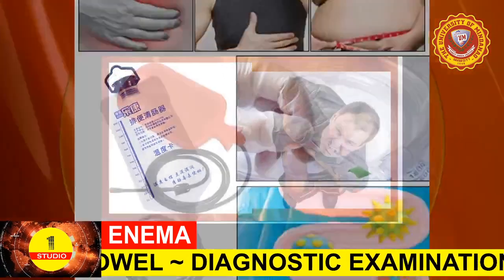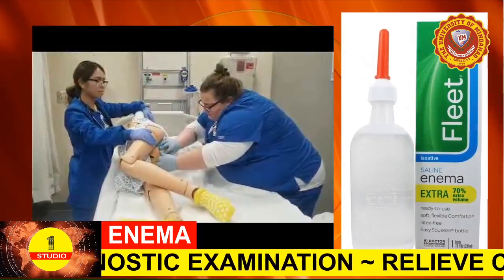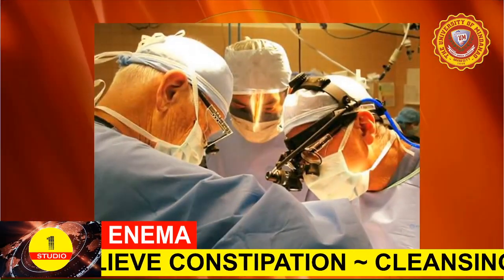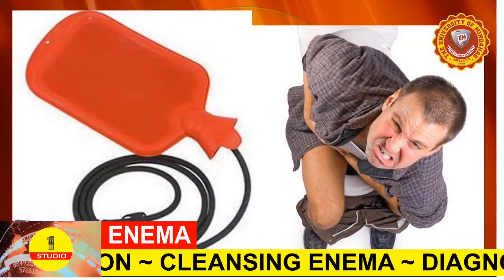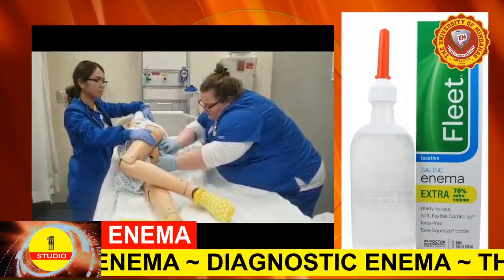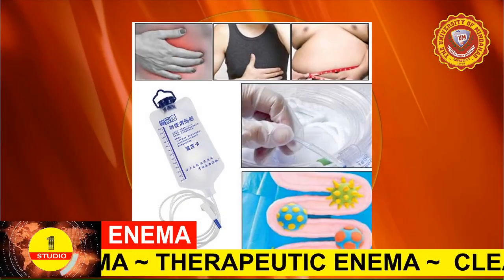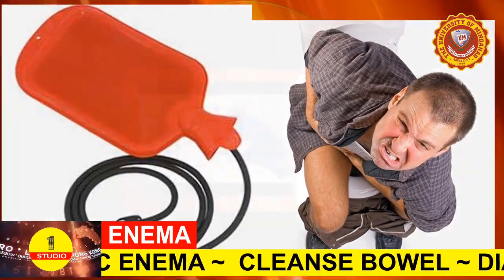There are three types of enema: cleansing enema, diagnostic enema, and therapeutic enema. Cleansing enema uses either a soap-suds solution or a fleet enema to prepare the bowel for preoperative procedures and to relieve severe constipation. Diagnostic enema is the administration of barium or a contrast medium for better visualization of the bowel or large intestine. Therapeutic enema is the administration of medications into the rectum for treatment of some disorders.